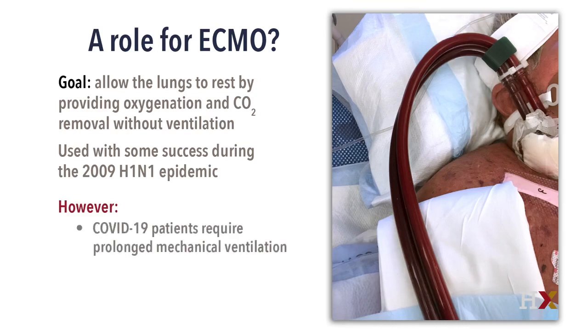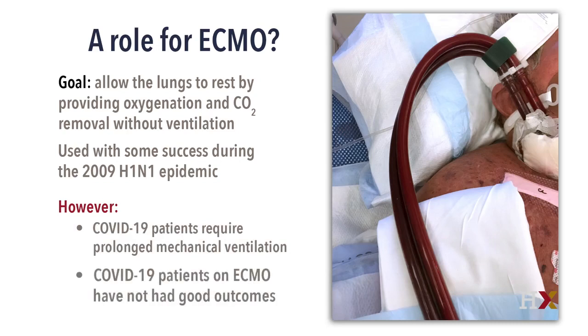Patients with COVID-19 are requiring prolonged mechanical ventilation, and those who have been placed on ECMO have not yet shown to have good outcomes. As such, the role in this epidemic is still to be determined. That concludes the video on mechanical ventilation in ARDS. For further information, please refer to the written materials.